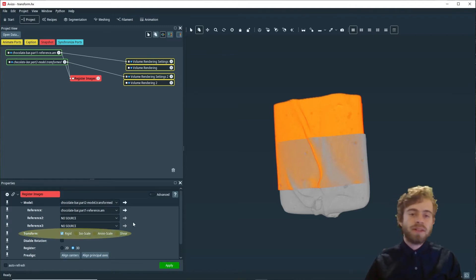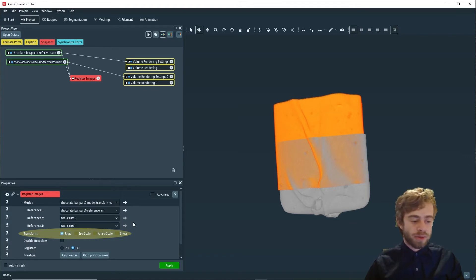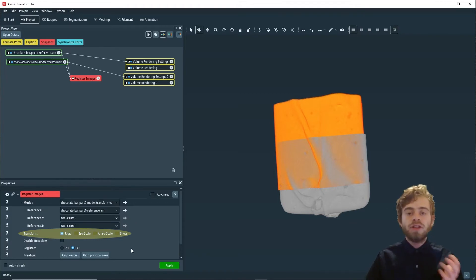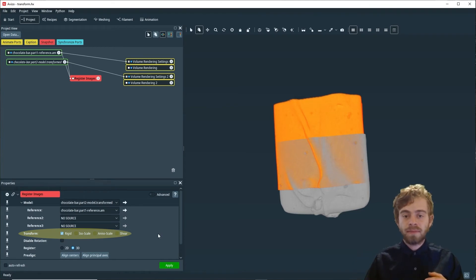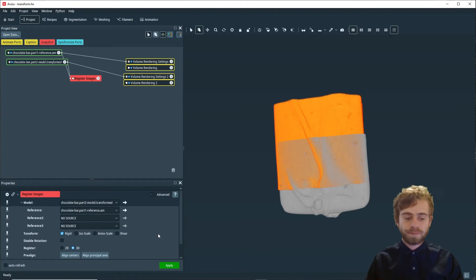There are four separate transform options you can choose from in the register images module. These control how many degrees of freedom we allow the module to move the dataset in the model port.